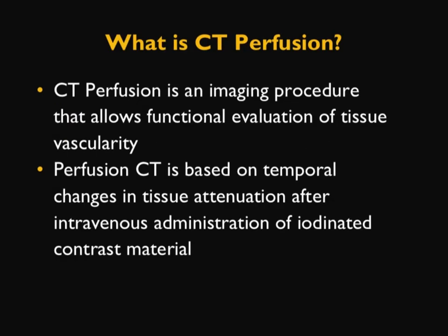So what is CT Perfusion? CT Perfusion is an imaging procedure that allows functional evaluation of tissue vascularity. Perfusion CT is based on temporal changes in tissue attenuation after intravenous injection of iodine contrast material.